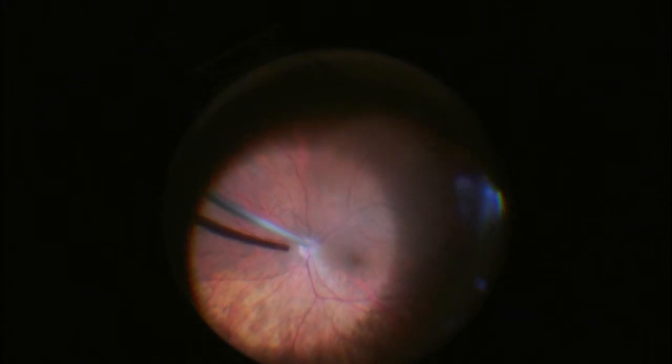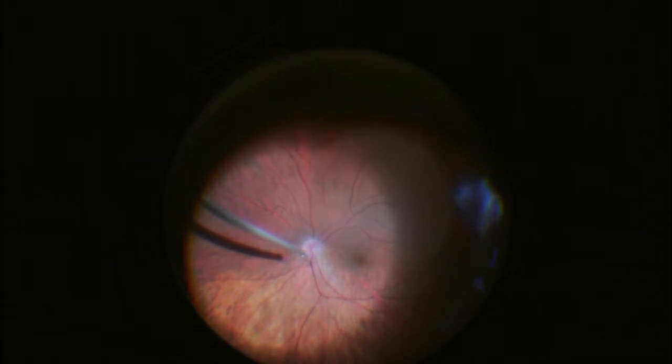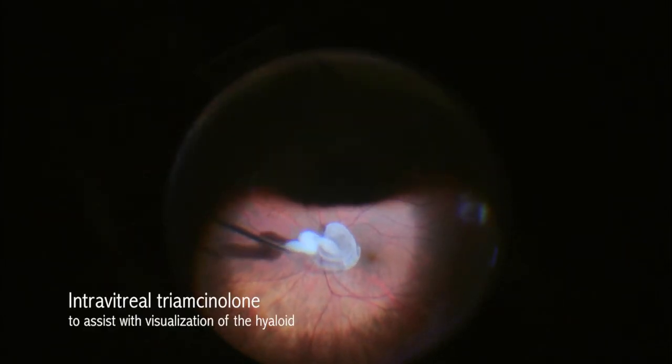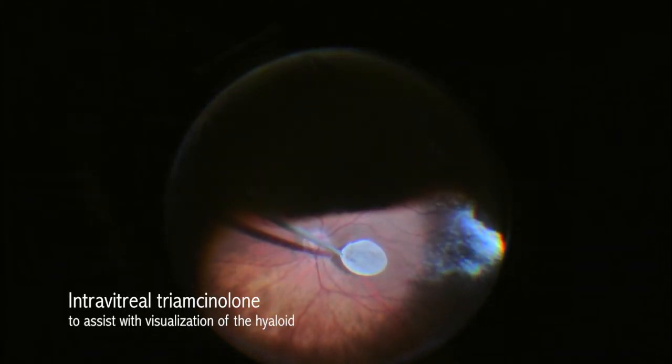I initially tried to induce the posterior vitreous detachment several different times, utilizing my Constellation 25-gauge cutter. When unsuccessful, I instill triamcinolone over the macular area to help identify the posterior hyaloid.